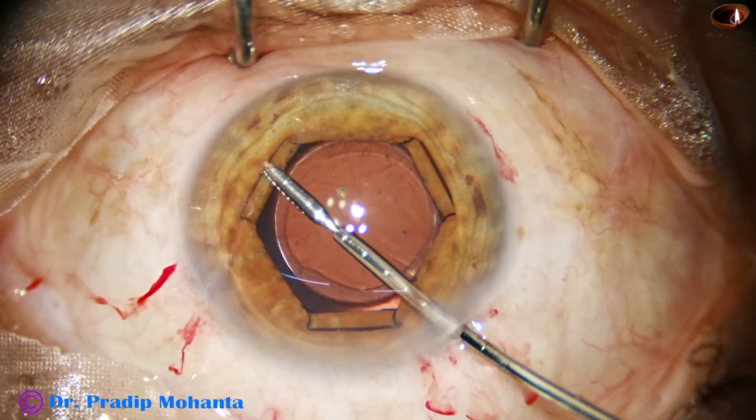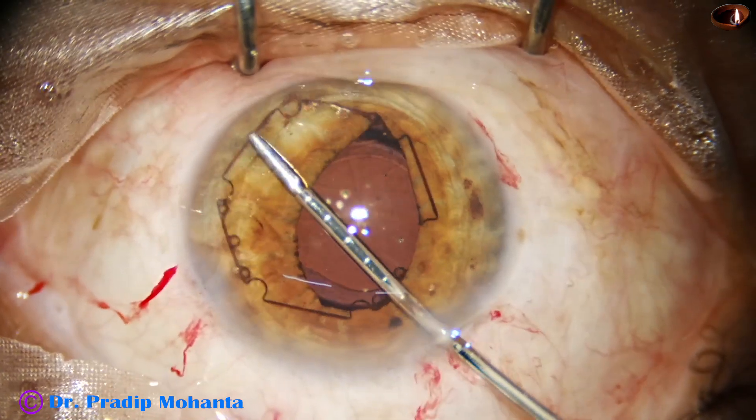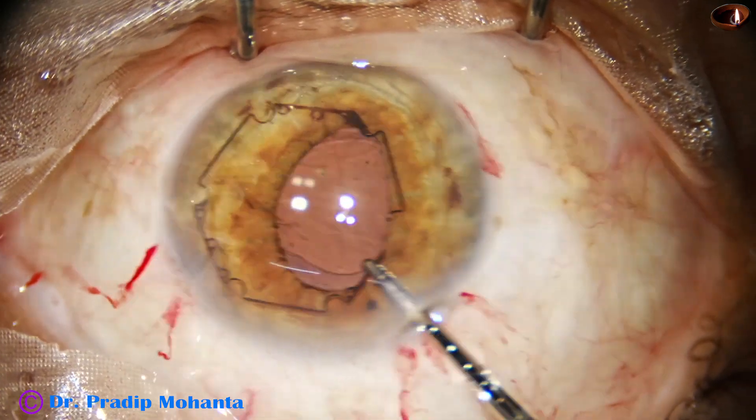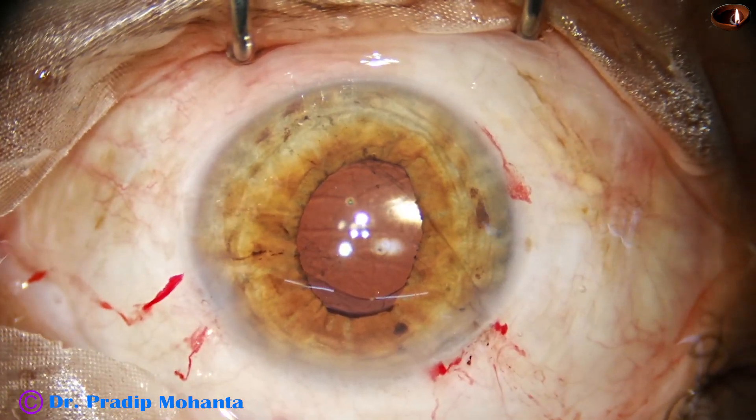And this is how we remove the B-hex ring. The VISCO is nicely cleaned — untuck and pull it out. As simple as that.